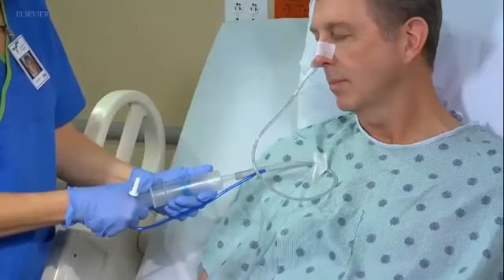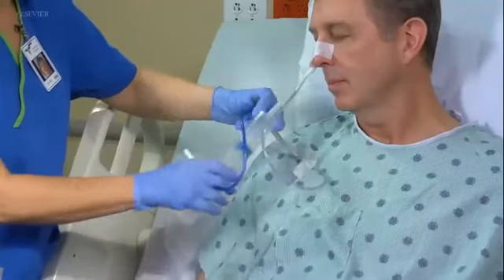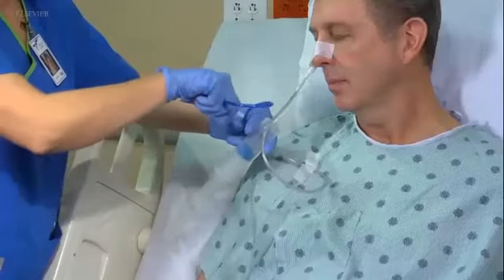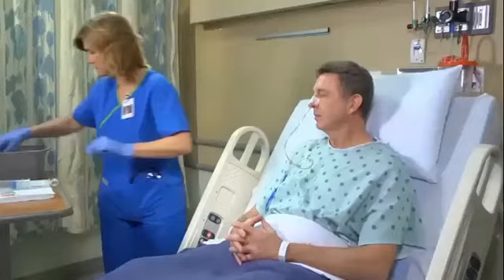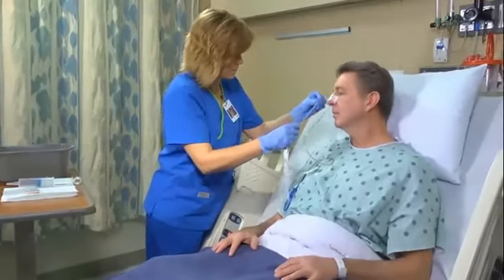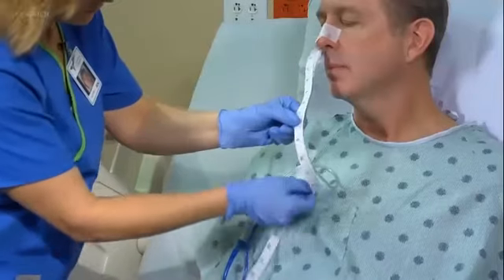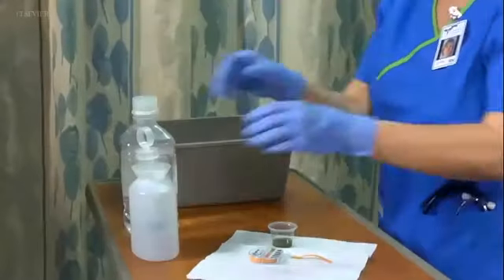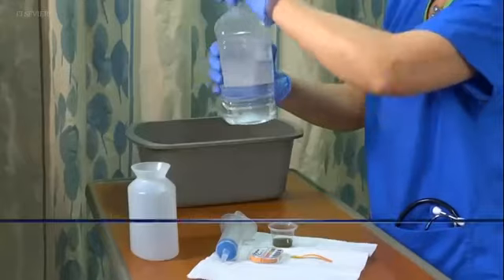If you're unable to aspirate fluid from the tube after several attempts, check to make sure an X-ray has been done to confirm placement. If proper placement has already been confirmed and the patient has no risk factors for tube dislocation, monitor the external length of the tube and watch the patient for signs of respiratory distress. Once you've confirmed tube placement, prepare to irrigate the tube.